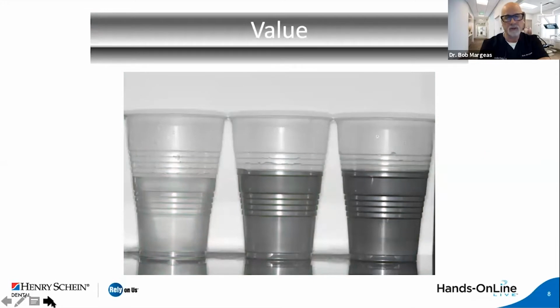So I don't want to really use too translucent of a tooth if I have a darker tooth. I don't want to use a translucent composite, I should say, if I have a darker tooth. The only way you can raise value, as I said, is either use a dentin shade of composite or use opaquers. The composite we're going to use today has a very, very nice opacity. So sometimes you can get away without using opaquers.